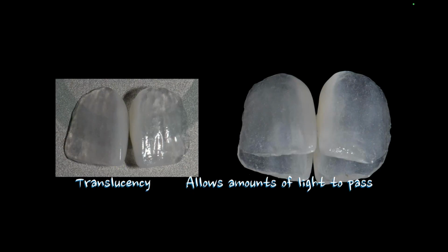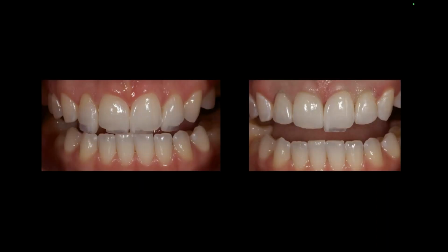So Jim, this might be the perfect example of opacity and translucency, right next to each other. But here's the difference: it looks so extreme, and when I put it intraoral, that changes, because now we're utilizing the coloration of the tooth behind it to blend in and give us some of the opacity or translucency back that we wanted.